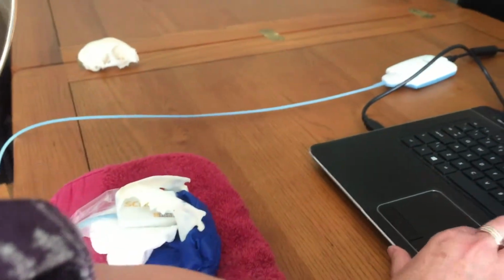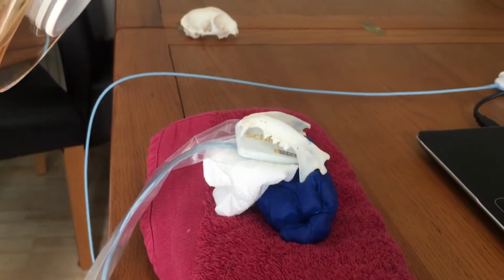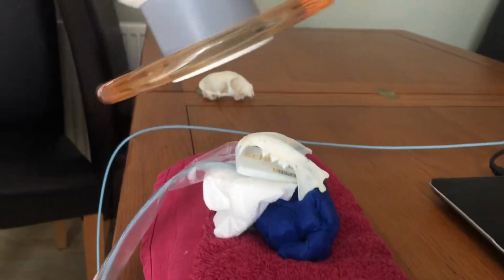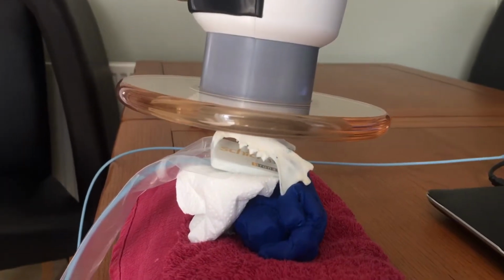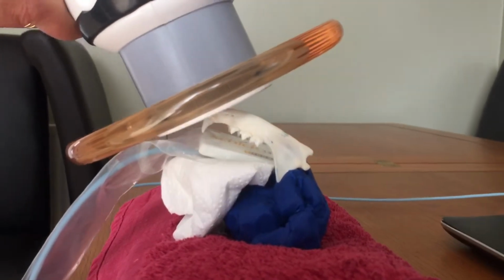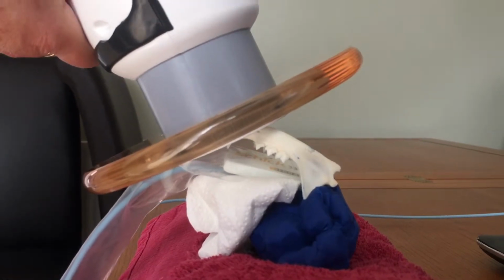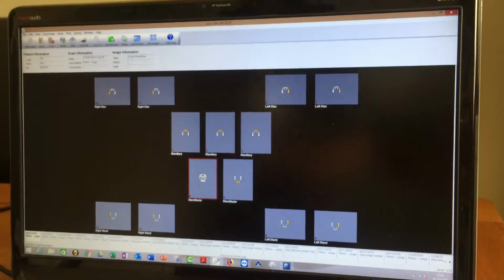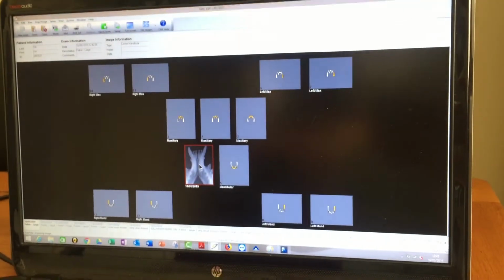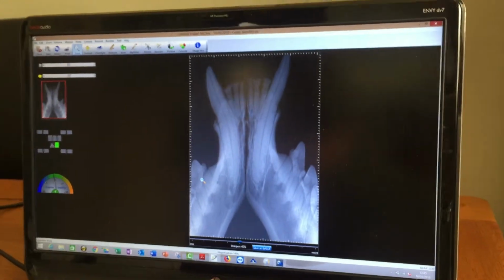Okay, now I'm just going to put the right box up on my screen. There we are. So what we're going to do first is take the incisors and canines. So this would be 90 degrees to the sensor. We don't want to be 90 degrees, we want to be about 70 degrees and nice and close to the incisors and canines. So I'm going to fire my Nomad now, and you'll see what we capture on screen there. So we should have a nice image of our incisors and canines. That'll come up on the screen large in a second. There you go. So incisors and canines, that's what we wanted to get.